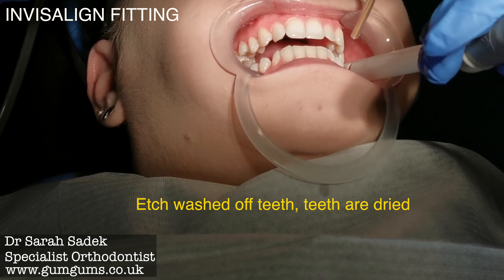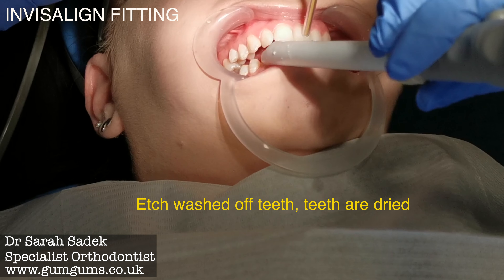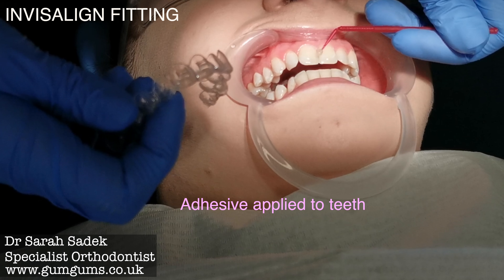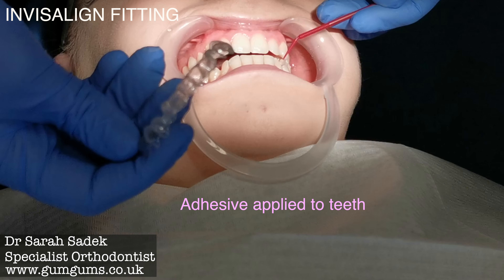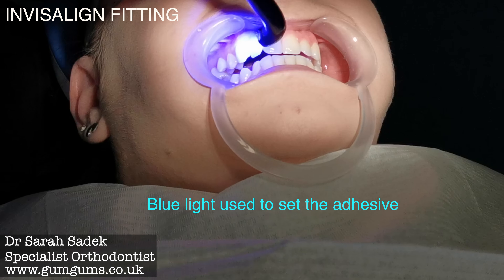The teeth are then dried. An adhesive is then applied to the teeth that have been etched. The adhesive is left on for a few seconds before being set with a blue light.